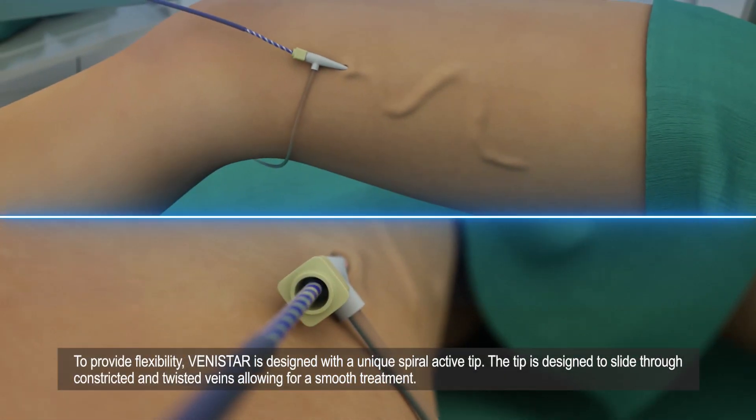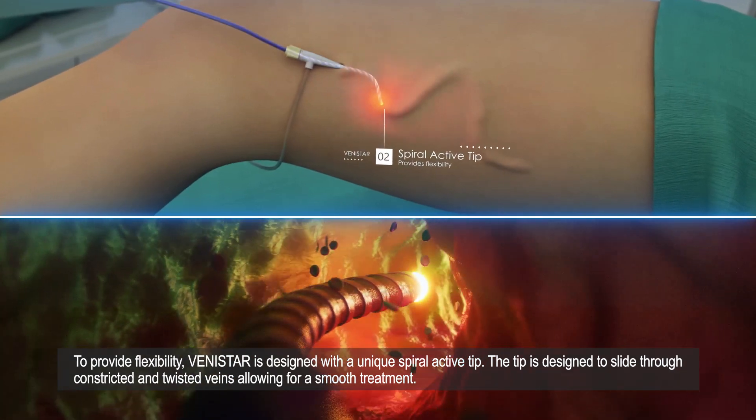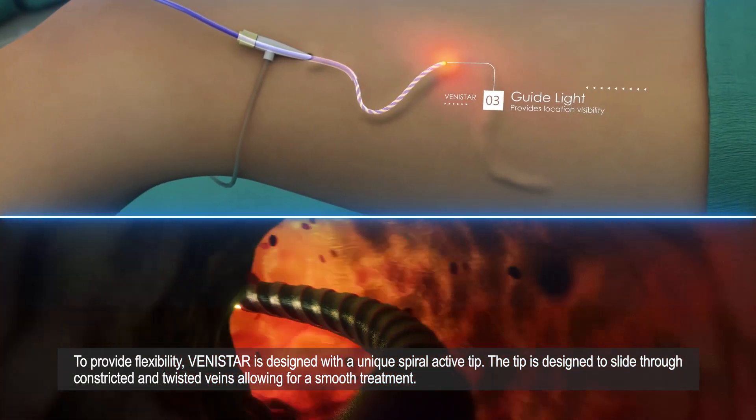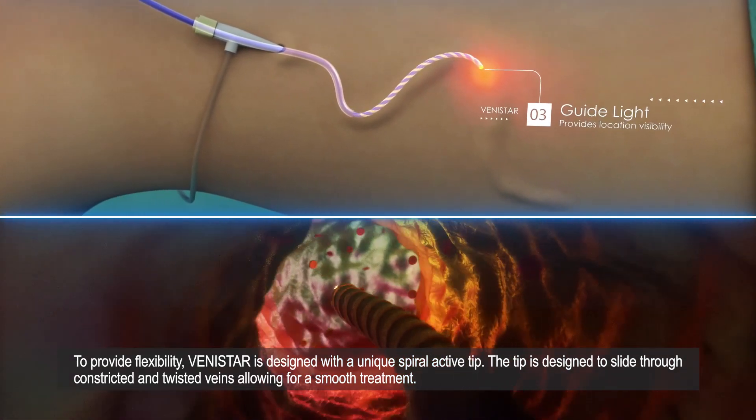To provide flexibility, Vinistar is designed with a unique spiral active tip. The tip is designed to slide through constricted and twisted veins, allowing for a smooth treatment.